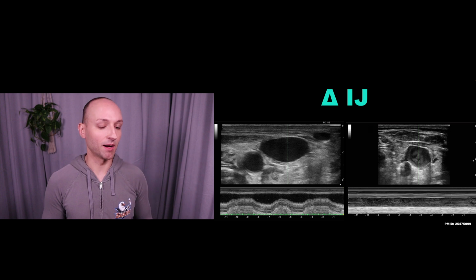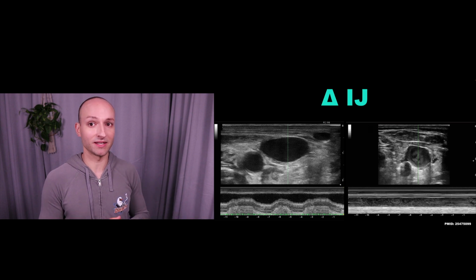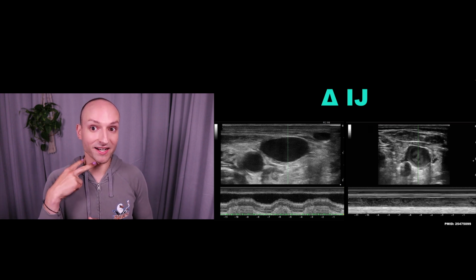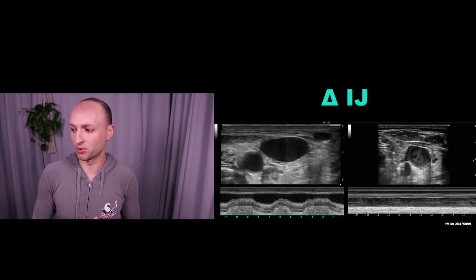With the IJ, this is another one that I was actually surprised that there was some literature to back this up. It's kind of cool because we really discussed not using M mode when you're measuring the IVC, and I'll talk about why. But with the IJ, they actually measure it in cross section, which is cool, in M mode, so you can easily see what the collapses are. I think it really makes the measurement pretty easy.